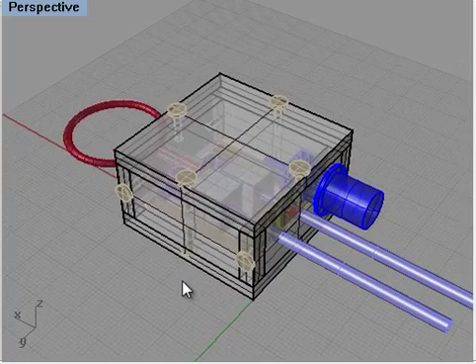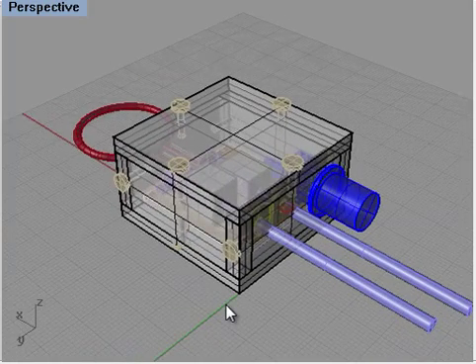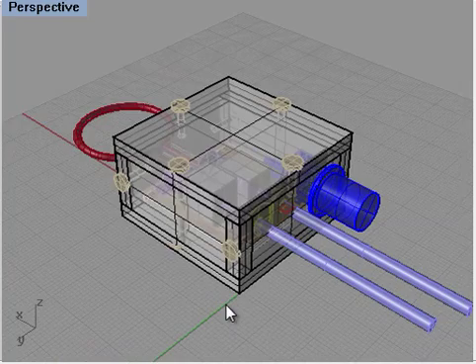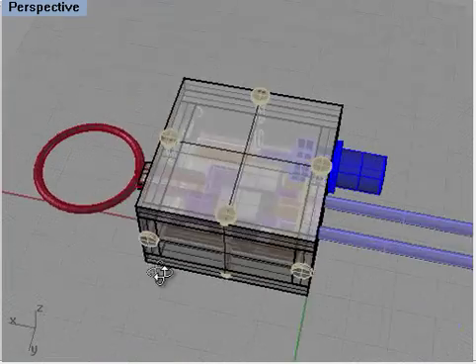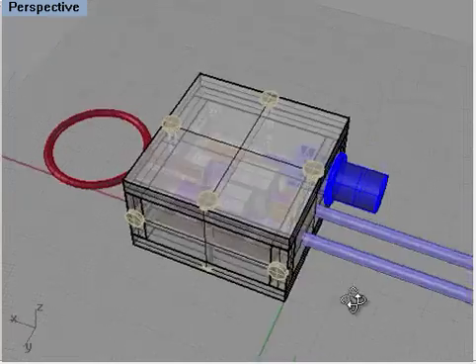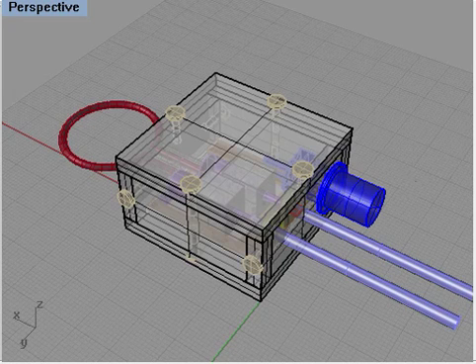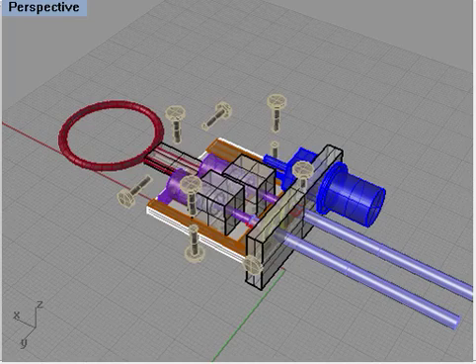You're probably familiar with a BNC cable, maybe from connecting your cable TV. It's a very common coaxial cable with a 50 ohm impedance. So let me just take away some of these layers here, so that we can look at the innards.